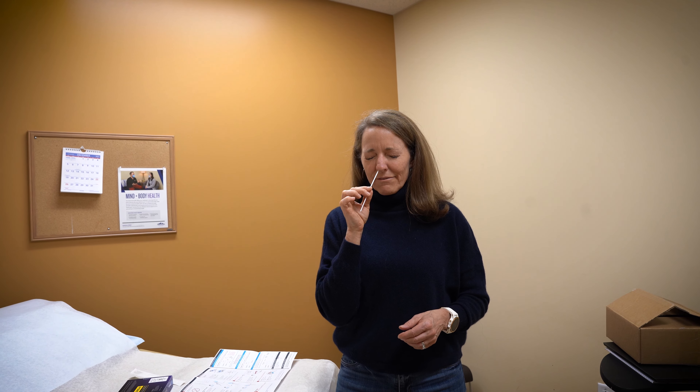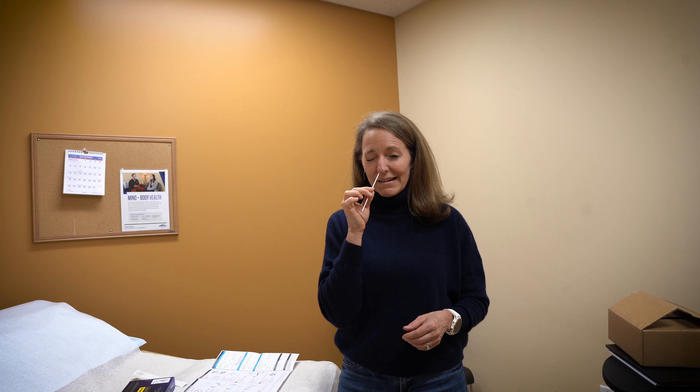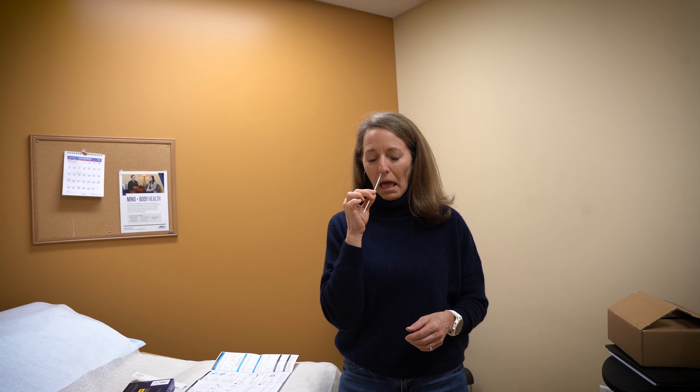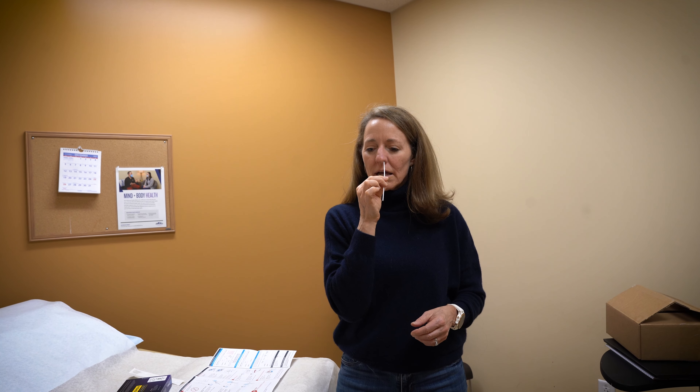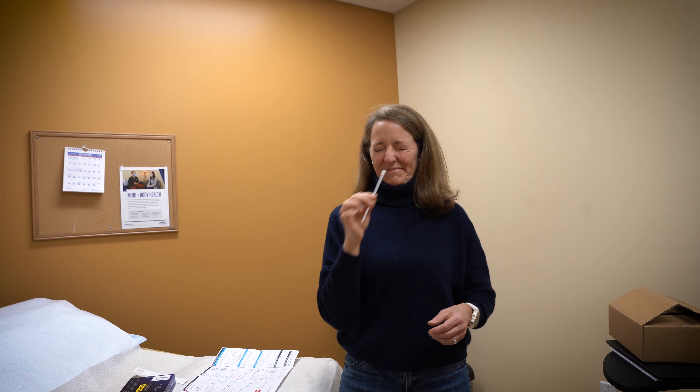And then I'm going to swab my nose. It has to go pretty far in for five circles on each side: one, two, three, four, five. You want to get a little bit uncomfortable with it, because if it doesn't go far enough in, you won't get enough mucus to get an accurate test.